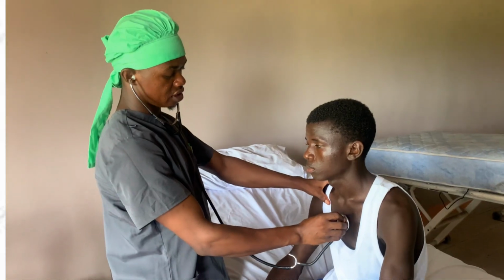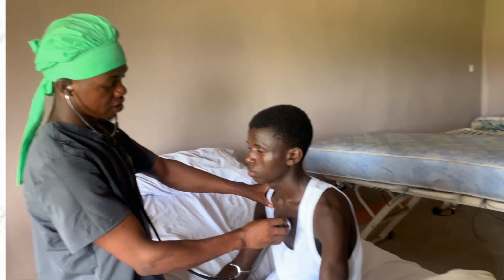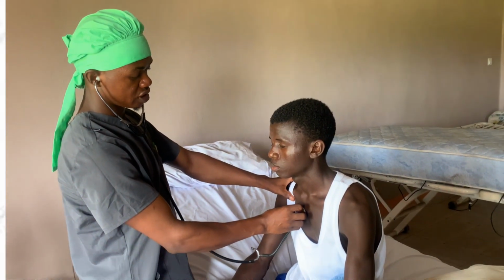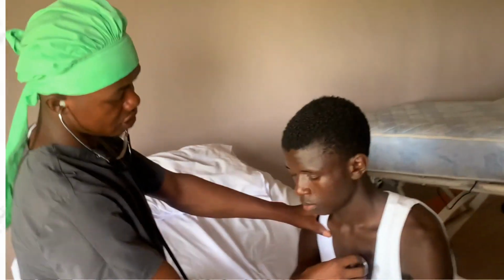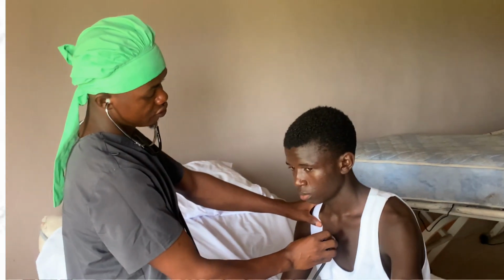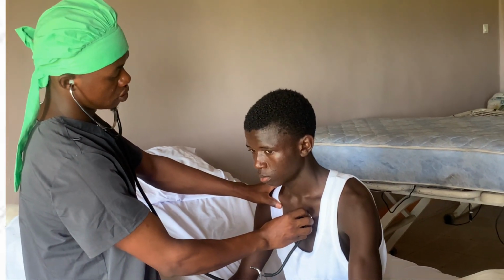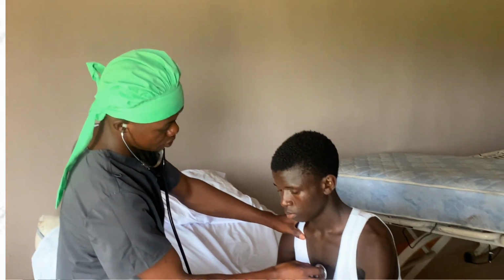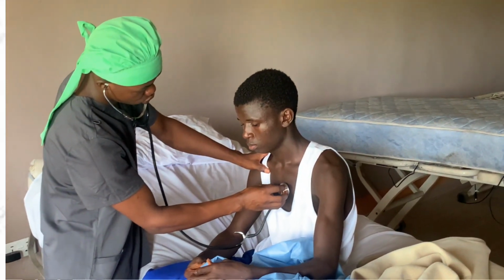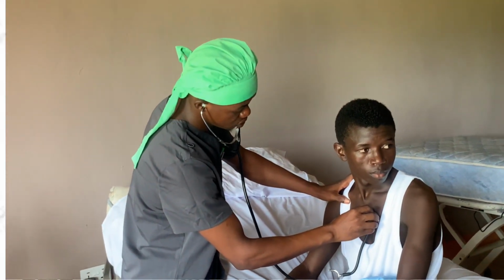Adjacent to the second intercostal space, now on the left-hand side of the sternum, where we can find the lungs, in the second intercostal space, we are palpating, we are auscultating for the pulmonic sound. Just one intercostal space, one rib space, we are going to the third intercostal space. We are auscultating for Erb's point, where we get the Erb's sound.